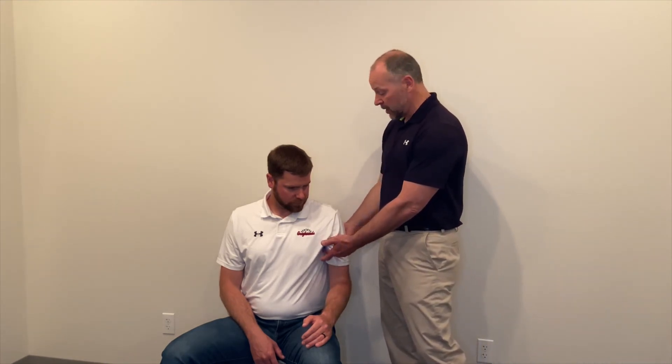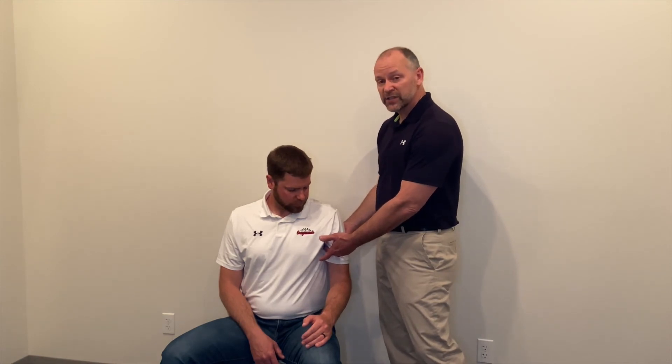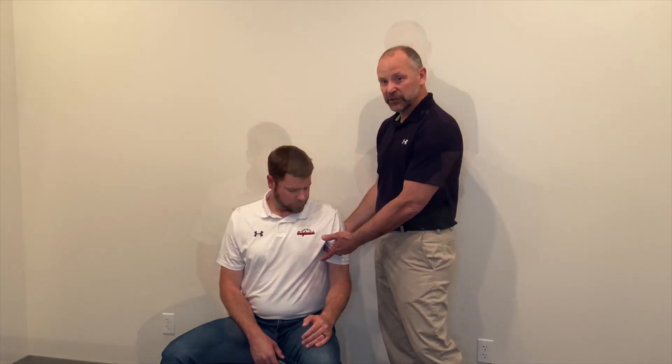To re-emphasize the point made earlier on the upper arm length measurement, it's very critical not to get your measurement point too high proximally. We're referring to that junction of the chest and the arm, and not pushing any higher than that point. You have to imagine where the top of your cuff is going to be, as that top edge is established by where you're starting from. Use some type of a straight edge and push that just to the stopping point, not compressing any soft tissue as your starting point.